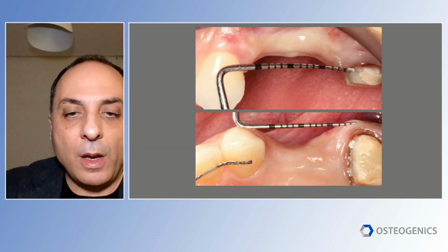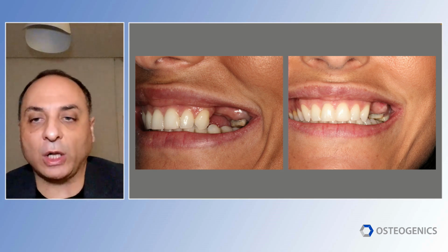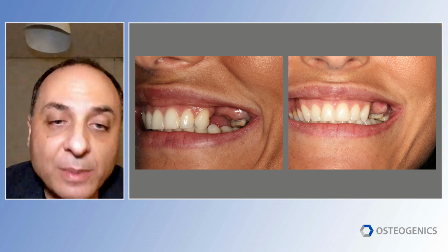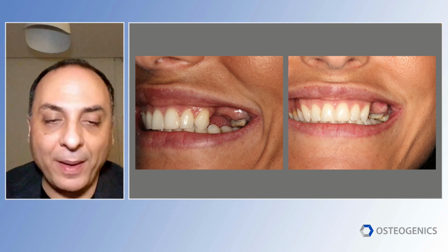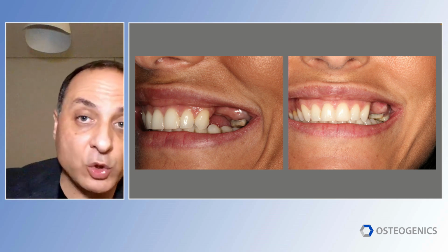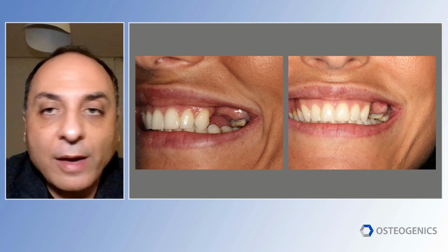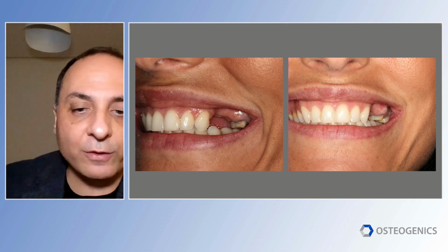So another quick example. Look at this case. For this case, this patient came to consult. She was not concerned that she doesn't have teeth. She knows that she can have implants. She had an accident, but her concern was more the concavity here. So when you have to build this complex ridge, the ideal indication is a titanium reinforced membrane. So titanium reinforced membrane should be your first choice. But because this specific patient was always traveling and was not around, and with a titanium reinforced membrane you need to have the patient always around, because in case of any misfortune, you need to intervene.